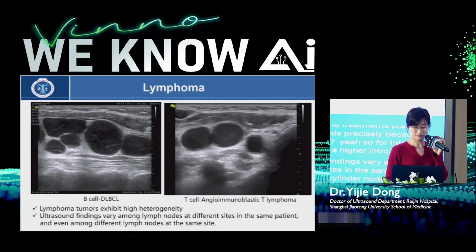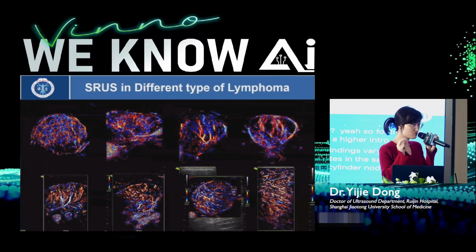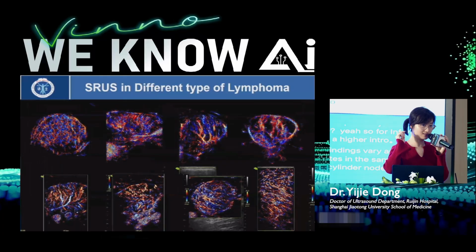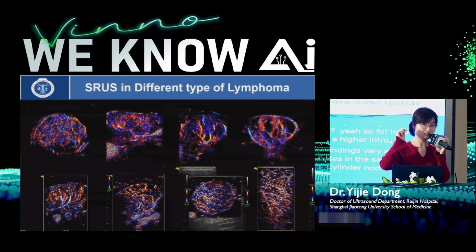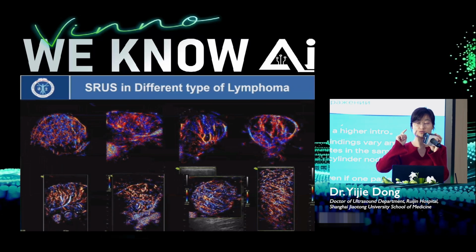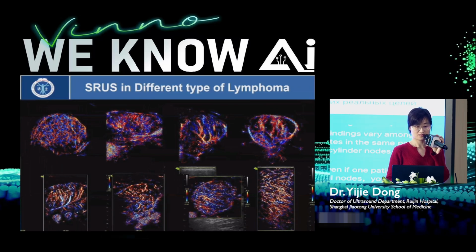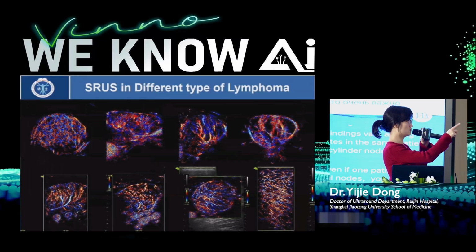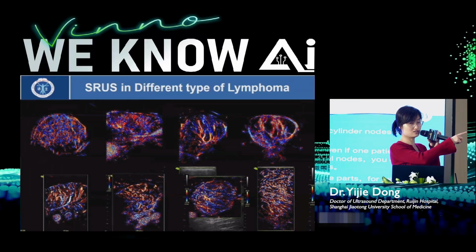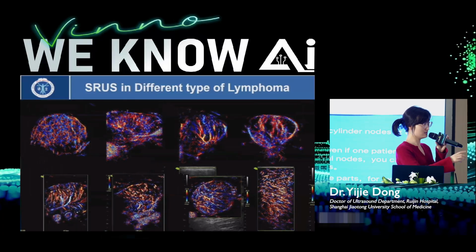So that's why we need very precise diagnosis of imaging. Then you can find our real targets. This is very important. This is our lymphoma enlarged lymph nodes here. These are all lymph nodes.